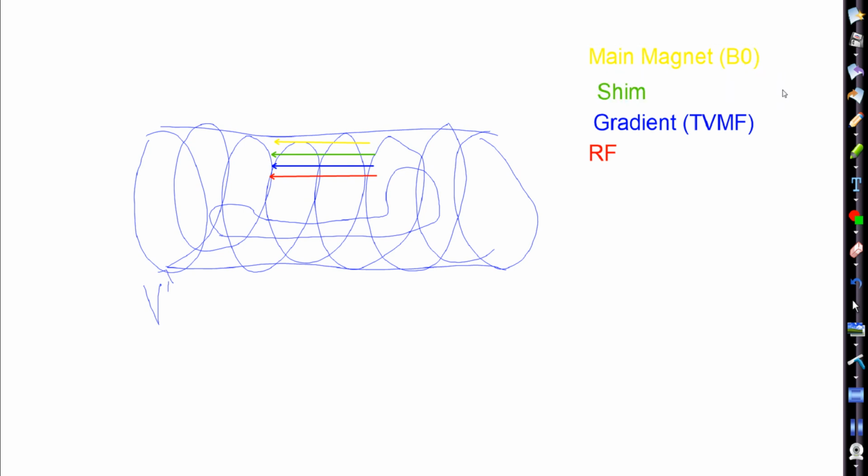All right, so we start off with the RF magnet. This is where we're applying an oscillating radio frequency pulse at the Larmor frequency of our hydrogen spins. Due to resonance and precession, we can flip those hydrogen spins to oppose the static magnetic field, and it flips into the transverse plane, and that's how we get our signal, because it reads out in the transverse plane. We have our receiver coils.